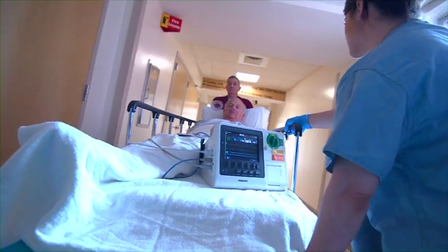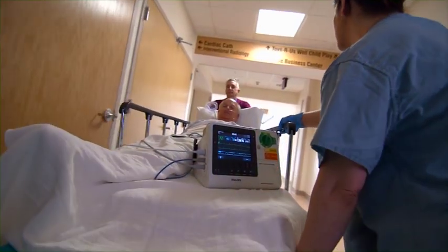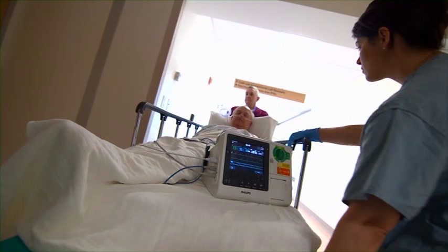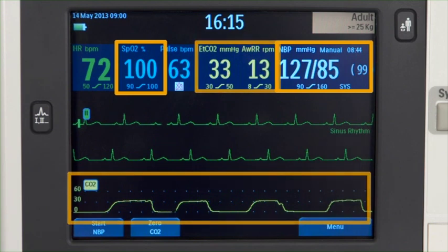In monitor mode, you can monitor one ECG waveform acquired through a three-lead ECG set and three ECG waveforms through a five-lead ECG set. Optional monitoring of pulse oximetry, non-invasive blood pressure, and/or carbon dioxide is also available.